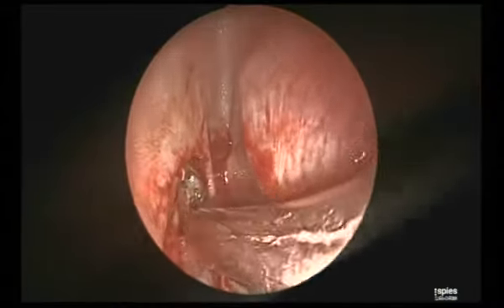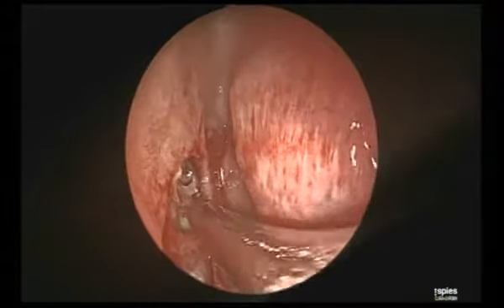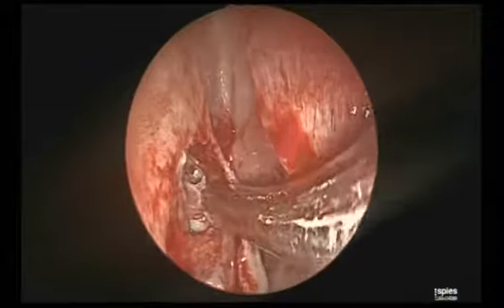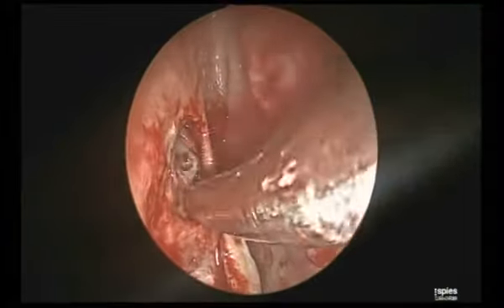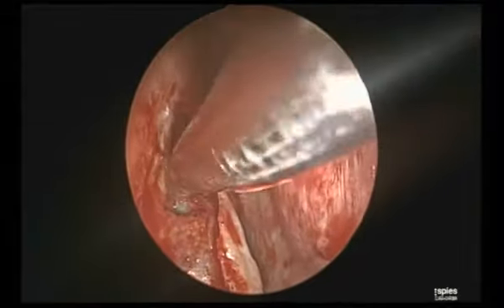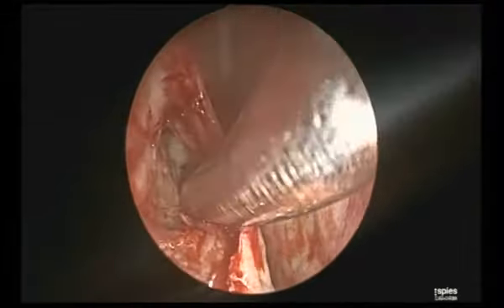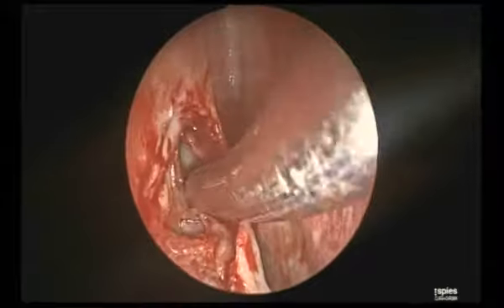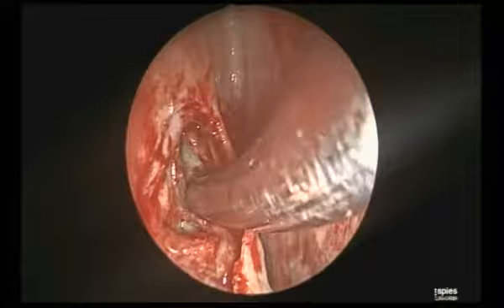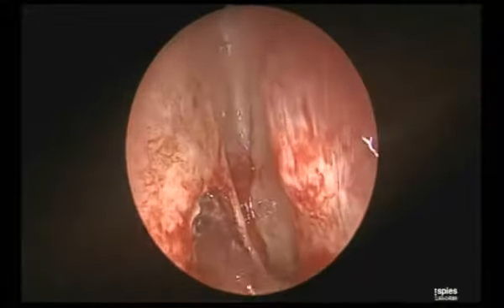See, my turbinate is my medial limit. I will see my bulla is below. I haven't done anything to the bulla. The superior attachment is still intact. Everything is intact anterior to that. Laterally now the lamina is my lateral limit, you can see. Fantastic. See my lateral limit like this, and see superiorly.